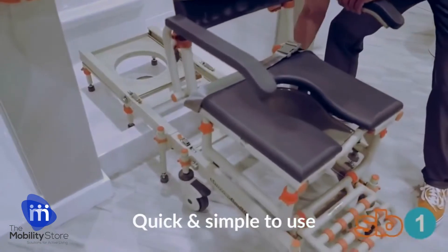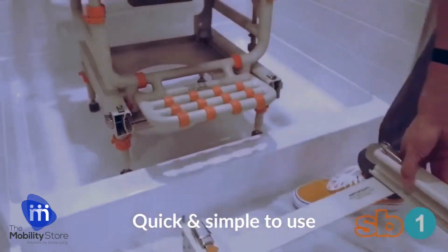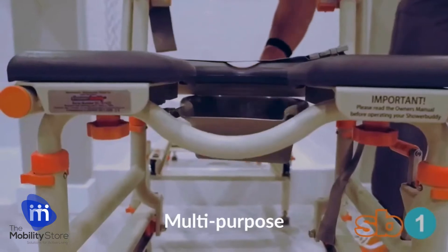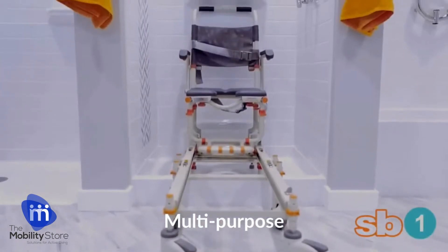Simply connect, transfer, remove the bridge, and swivel to face your shower head. This solution reduces multiple transfers, allowing users to use it as a bedside commode, over the toilet seat, and shower transfer system.